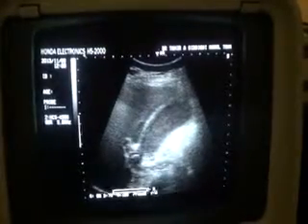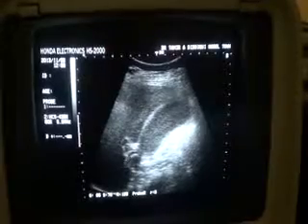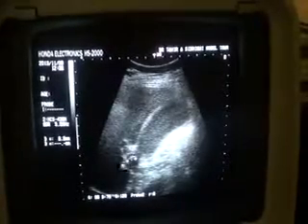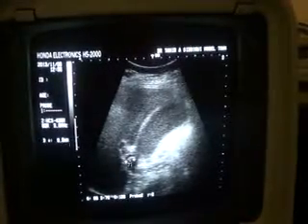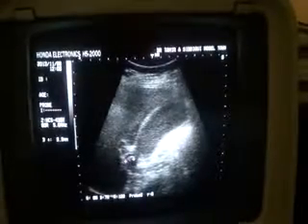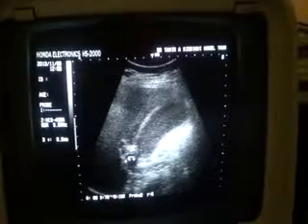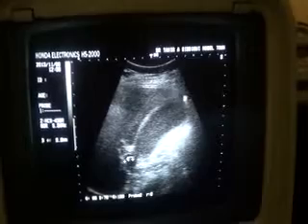Now you will see a calculus. This is a calculus in the region of the gallbladder neck. This is the gallbladder neck region and you can see a calculus measuring 9.8 millimeters in the region of the gallbladder neck, leading to thick-wall gallbladder full of sludge.